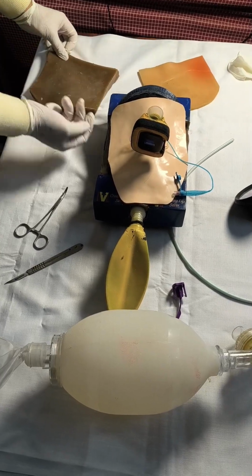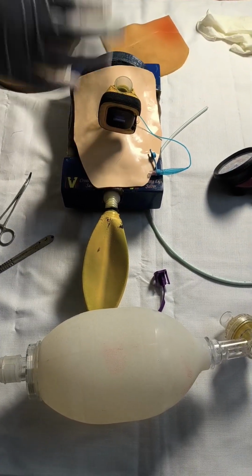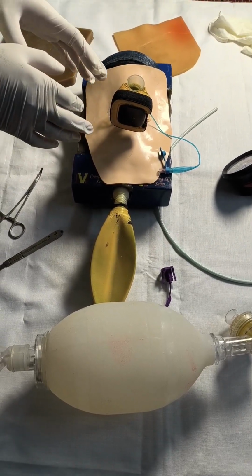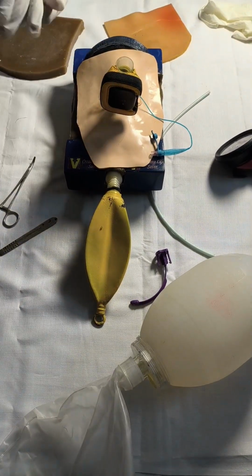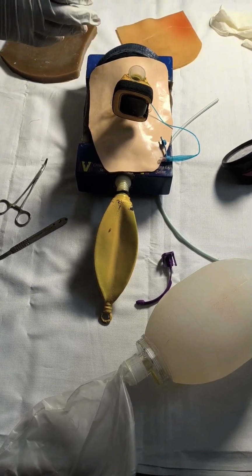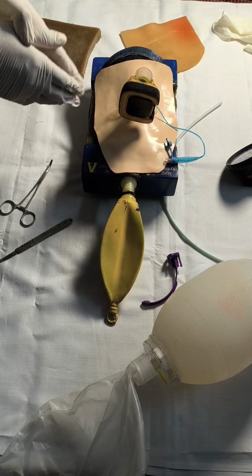So the idea is that India needs deliberate practices and a mini model. You don't have to go to a skill lab or to some other place or to a simulation center. You can do these deliberate practices in your offices. That is why we have designed this, and hopefully with deliberate practices and the mini model, we will be able to master those high stake procedures.